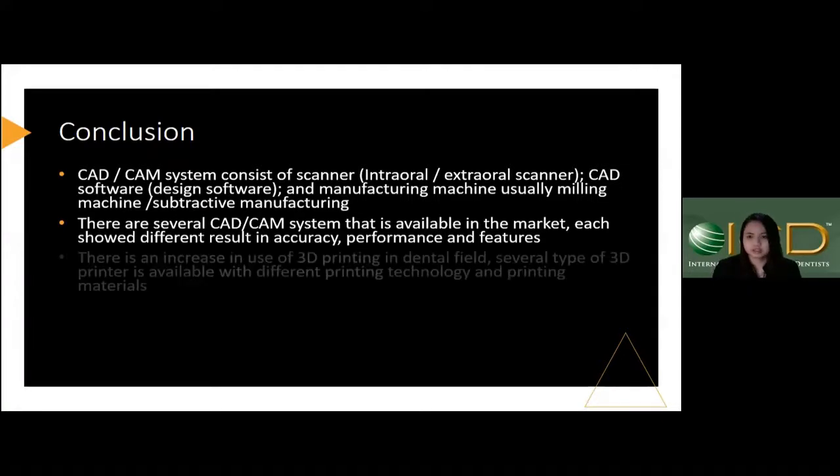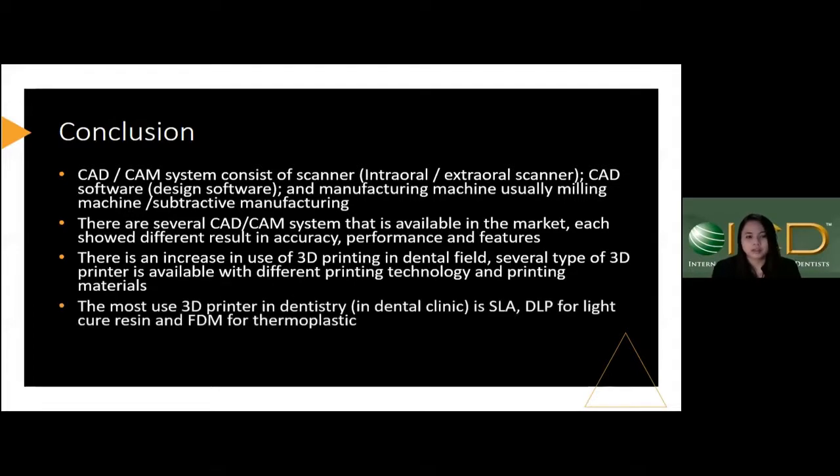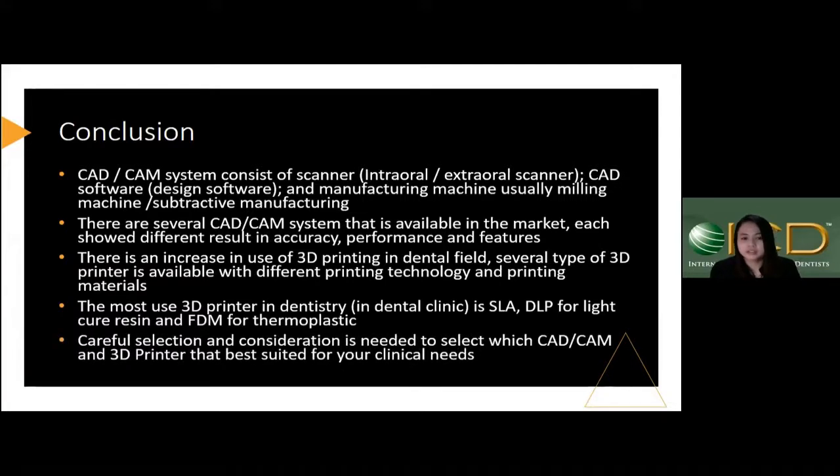performance, and features. There is an increase in use of 3D printing in the dental field, and several types of 3D printer are available with different printing technology and printing materials. The most used 3D printer in dentistry, especially in dental clinics, usually is SLA or DLP for the light cure resin materials, and FDM for thermoplastic. And careful selection and consideration is needed to select which CAD/CAM system and 3D printer is best suited for your clinical needs.